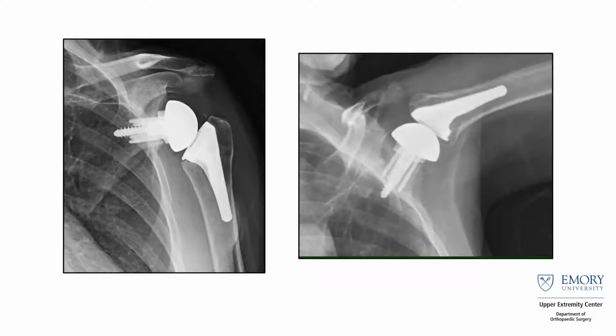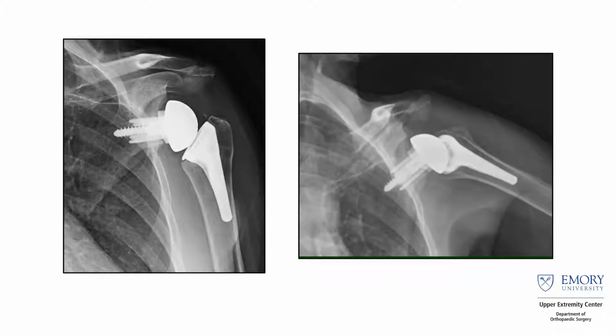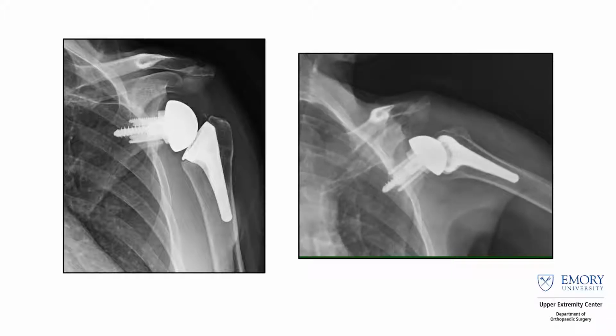How much is their glenohumeral joint actually moving? How much is their scapulothoracic joint moving? How are they actually rotating? What's happening with the implant? Is there impingement on their acromion? Is there impingement inferiorly in adduction?